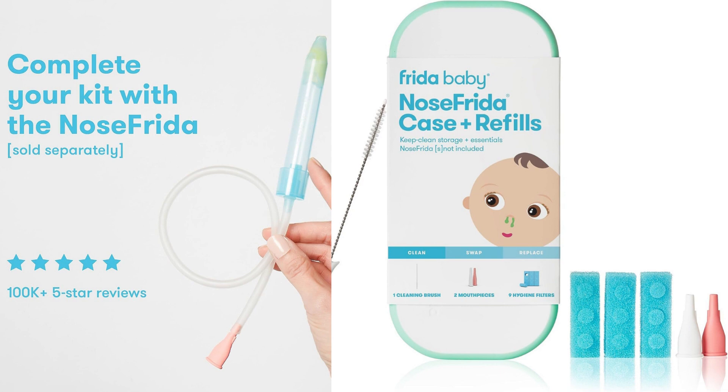I recently had the opportunity to try out the Frida Baby Nose Frida Case Plus Refills, a cleaning and storage solution designed for the popular Nose Frida, the Snot Sucker Nasal Aspirator. Here's my review of the product.